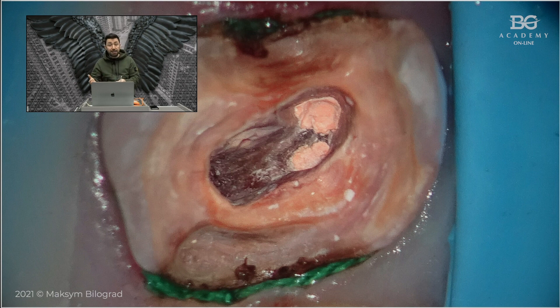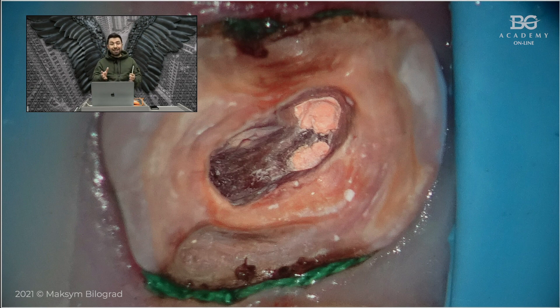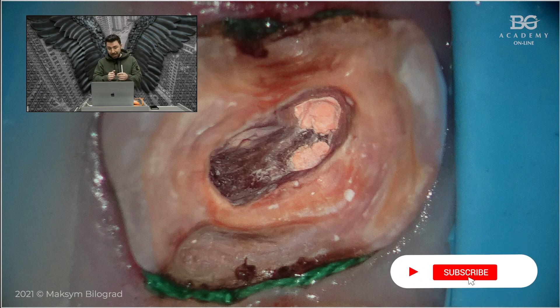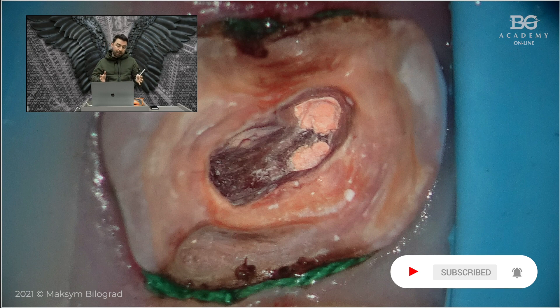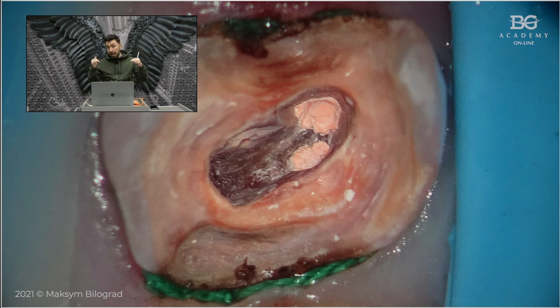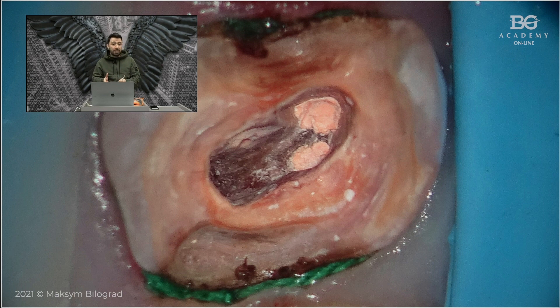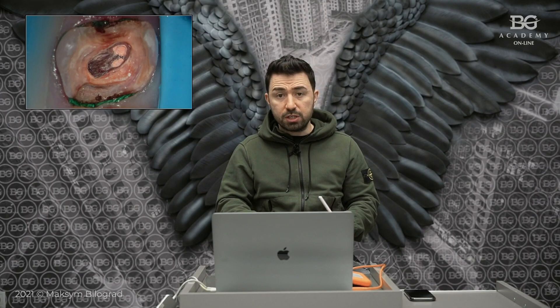On molars we have mostly vertical forces, so we are not afraid of deep bonding failing due to lateral occlusal forces. Another thing is the pulp chamber — if you have a very deep pulp chamber, the chamber itself is a very good retentive zone. Using just composite with no posts will work perfectly. In this case we also had walls from the palatal and buccal sides higher than two and a half millimeters, giving us a lot of retention. That's why we decided to just do a composite core build-up, then preparation.